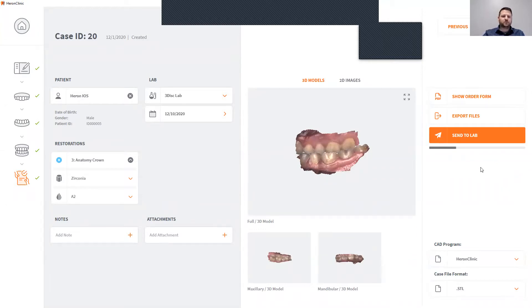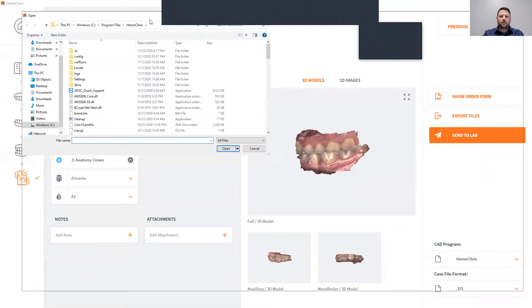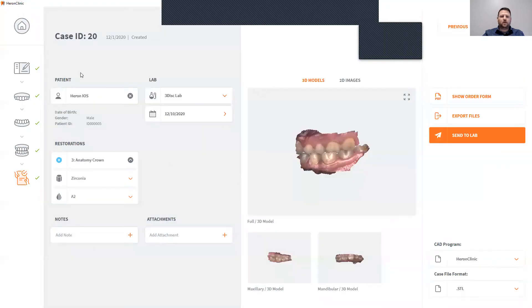Another nice thing about our prescription page: if you're doing an ortho case and need facial photos, you can use your high definition camera to take those photos. Simply upload those photos to your computer and attach them with the attachment function, and then you can send all those to your lab as well. That is a quick demo of the Heron IOS. Thank you.